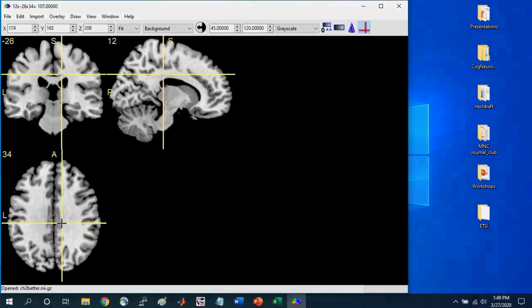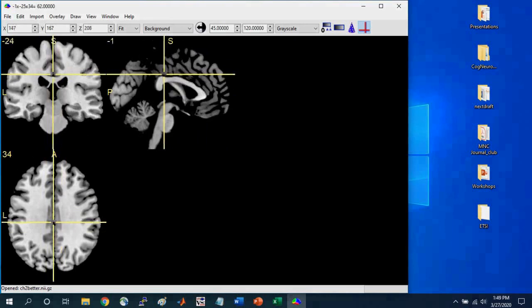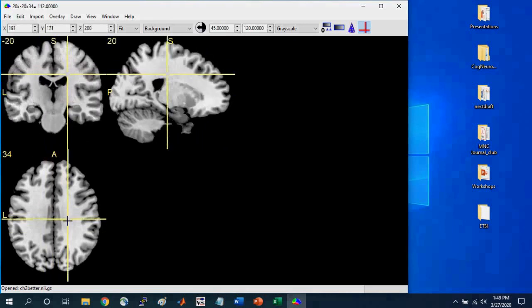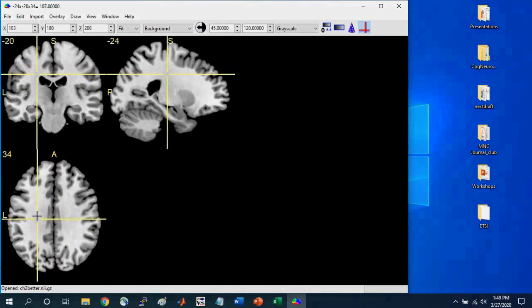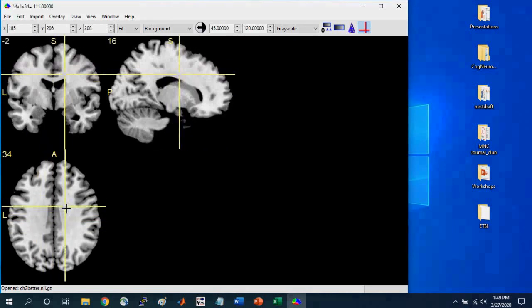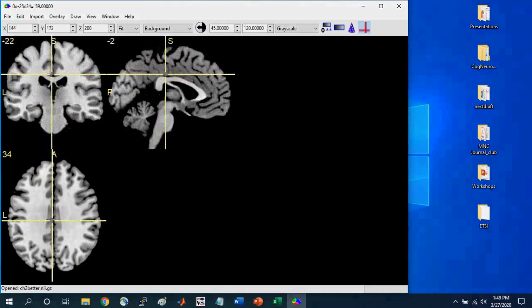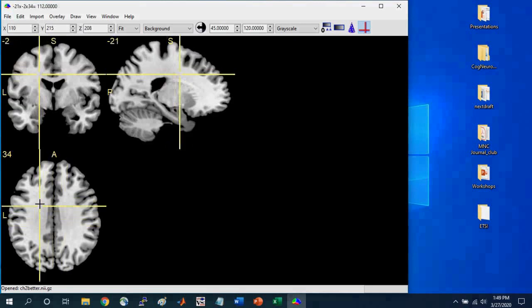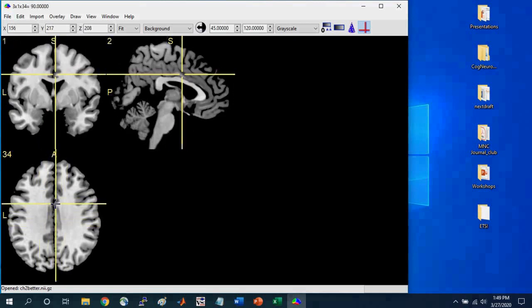And notice that here as I'm moving around in this particular plane, you see that the other two orientation planes, they change. And so this is because it's a three-dimensional image.